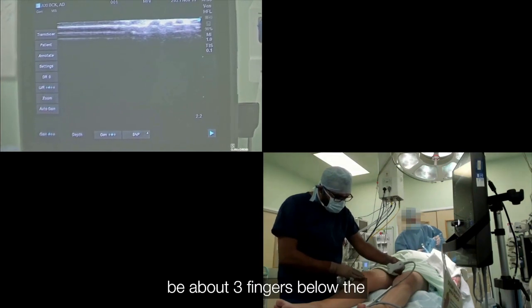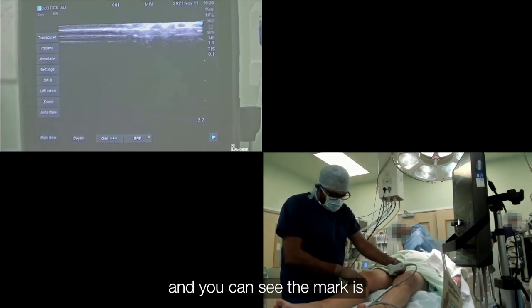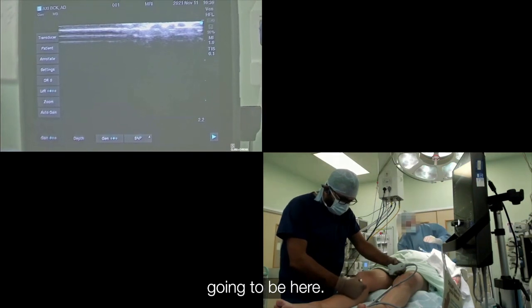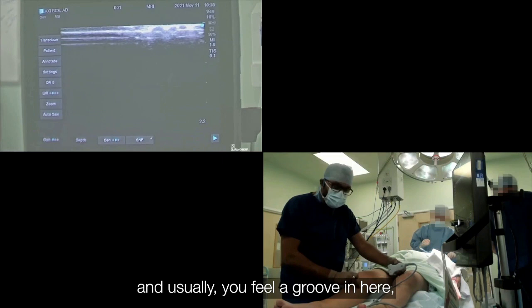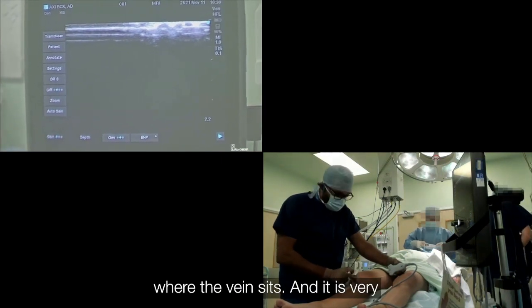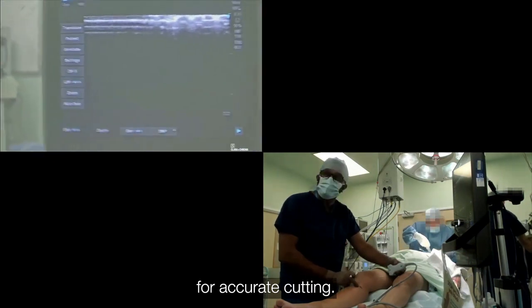Usually, the cut is going to be about three fingers below the medial border of the tibia, and you can see the mark is going to be here — I am going to make the cut in here. Usually you feel a groove in here where the vein sits, and it is very essential to know this groove for accurate cutting.